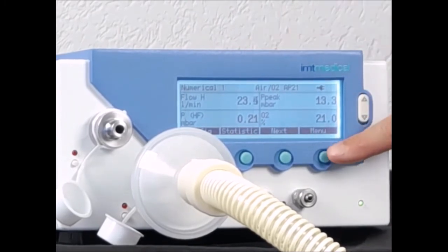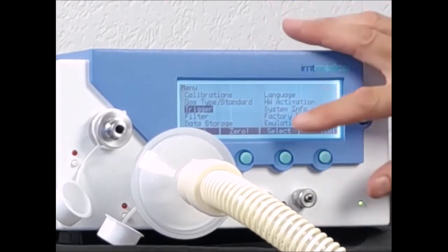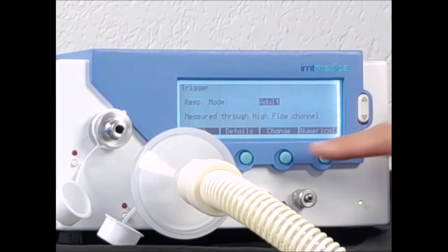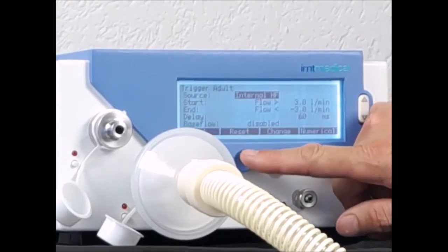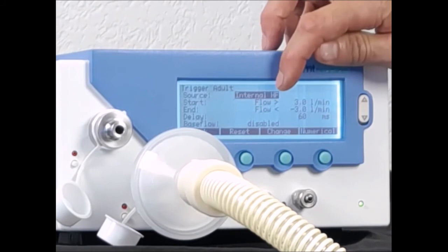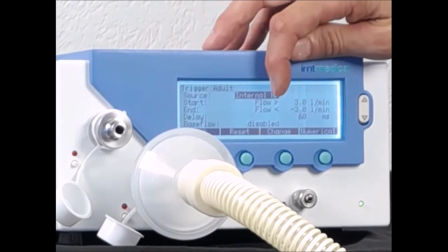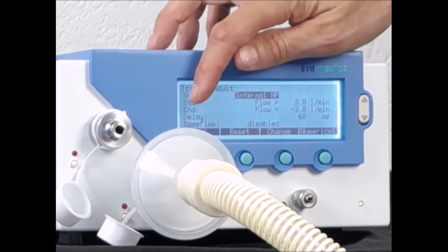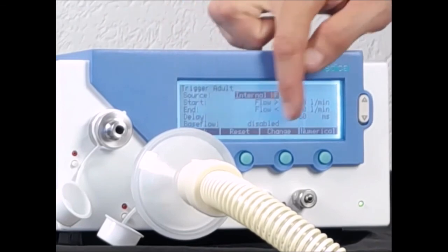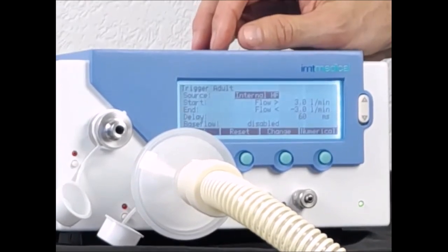Next, I want to check the trigger settings for adult ventilation. I select the trigger — it is set to adult. I can check the details: I have a start trigger, flow plus 3 liters per minute rising edge, and an end trigger at the start of expiration, flow falling edge minus 3 liters per minute. Delay is 60 milliseconds and base flow is disabled. For more details on these settings, please check our other video which deals with ventilation parameters and trigger settings.